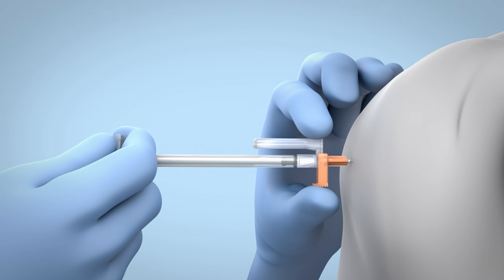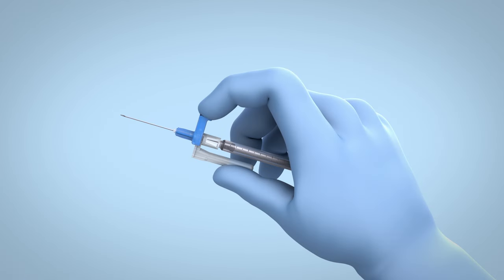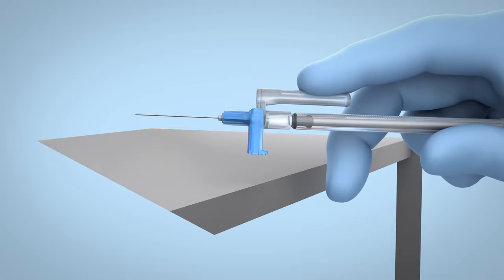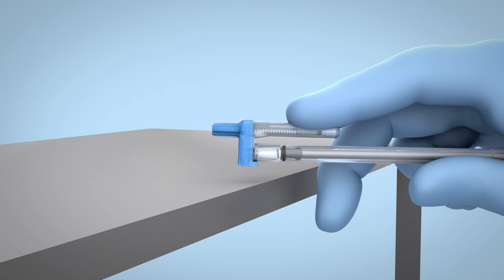Activation can be achieved in a variety of ways. The EasyPoint needle may be activated either before or after removing the needle from the patient. Activation of the retraction mechanism after withdrawing the needle may cause minimal splatter.